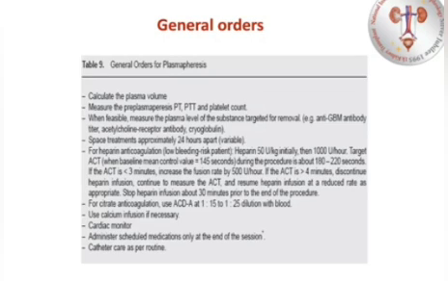For citrate anticoagulation, use ACDA at a 1 to 15 to 1 to 25 dilution with blood. And use calcium infusion if necessary, cardiac monitoring, and administer scheduled medications only at the end of the session, because most of the medications will be removed by the plasmapheresis.